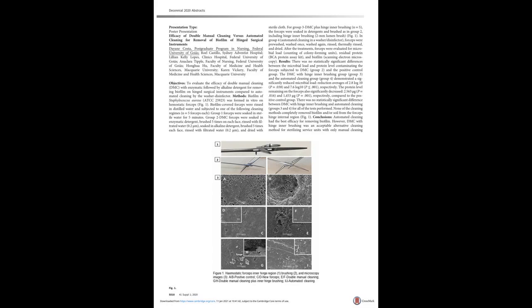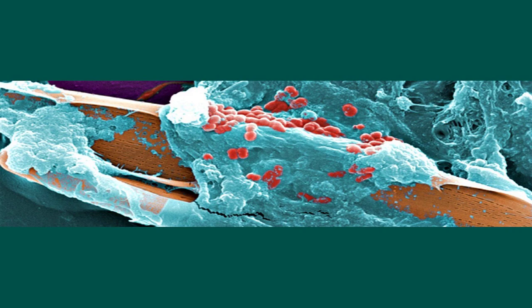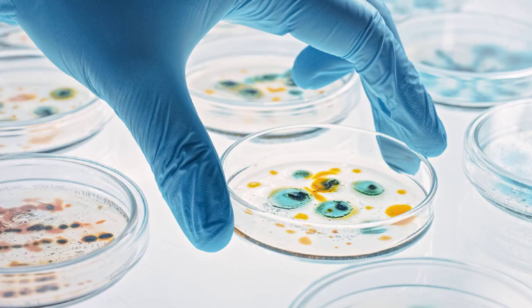Once biofilms form, they can be hard to remove. The cleaning process must ensure biofilm-free instruments because biofilm has significant real-world impacts. Since treating it with antibiotics is nearly impossible, anyone it infects could become dangerously ill. As a result, researchers and medical professionals have had to get creative to find solutions.